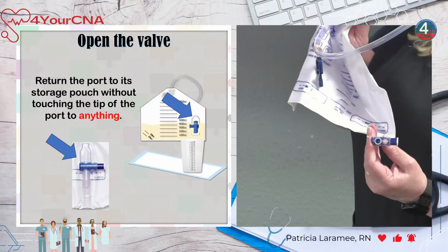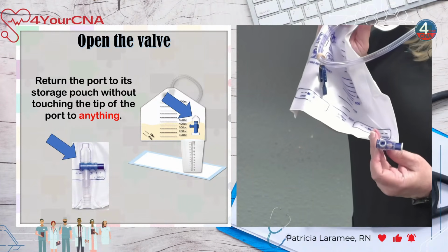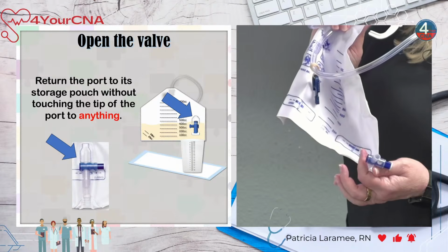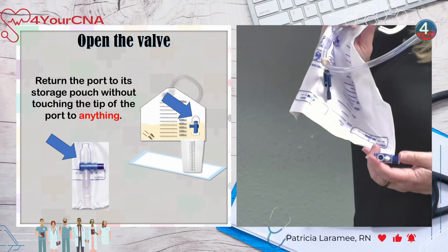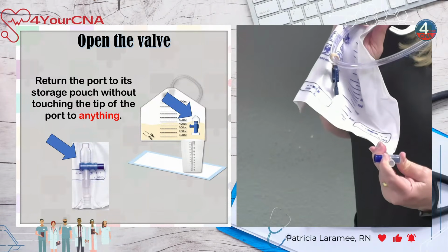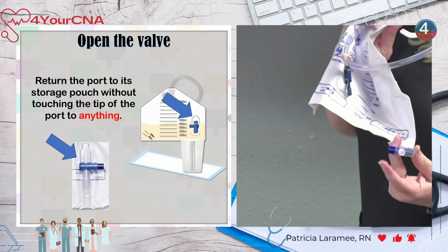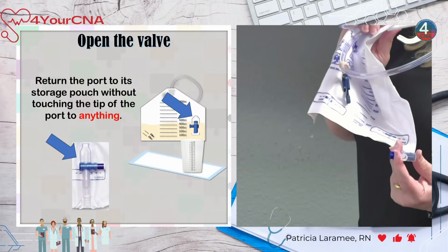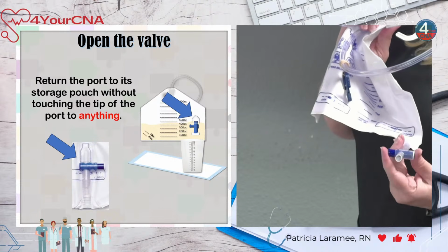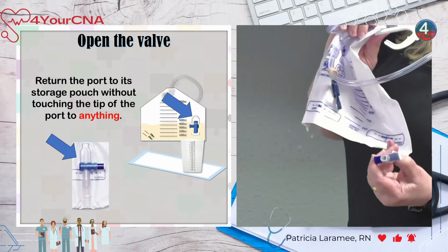See how it's closed? Okay, so when you're getting ready to open it, we're going to keep our hands below that port. I don't want to be up here. This would make it way easier for me to open it. I have more leverage. But if I put my finger up here, this is where bacteria are going to enter. So we never put our finger near this port. We stay behind the T. Make sense?